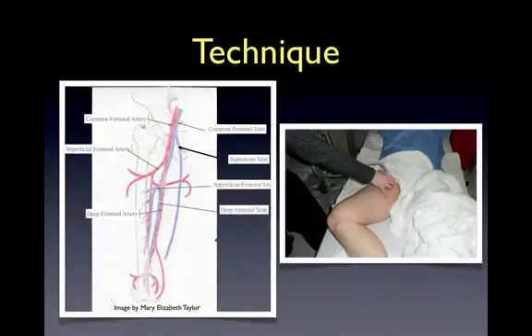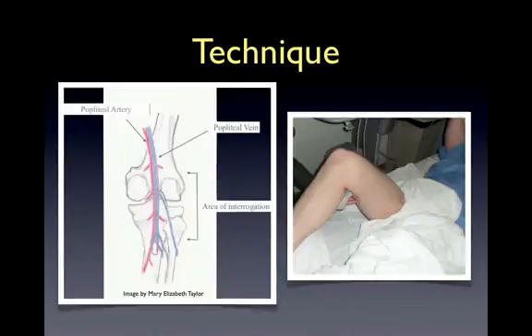Begin by identifying the common femoral vein at the inguinal ligament, scanning distally to the medial entry of the greater saphenous vein. Continue to scan down to the bifurcation of the common femoral vein into the superficial and deep femoral veins. Next, identify the popliteal vein in the popliteal fossa behind the knee and scan distally to the trifurcation of the popliteal vein.